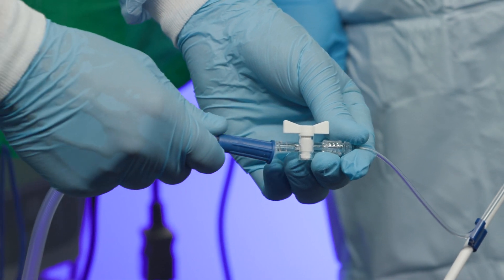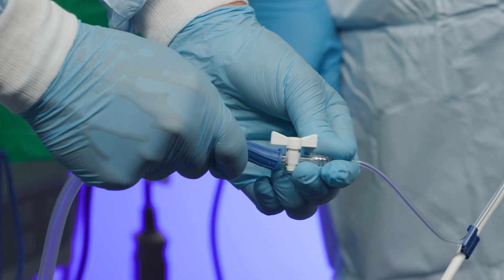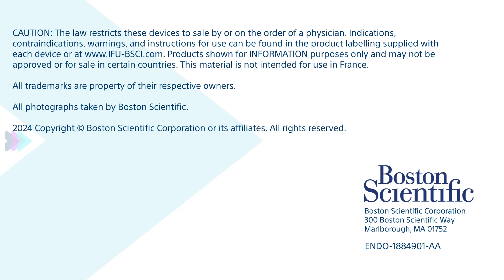If desired, connect a suction source to the aspiration port.